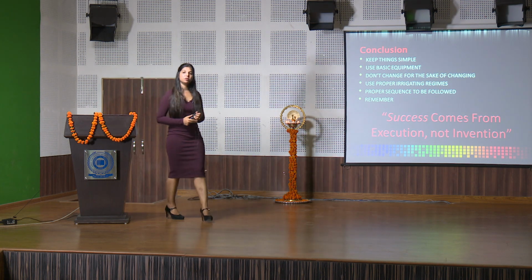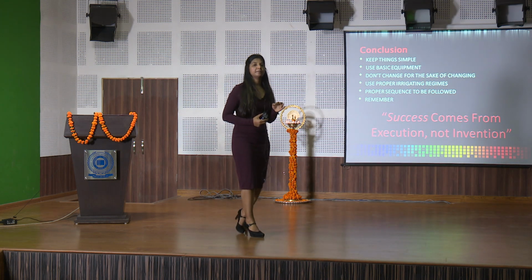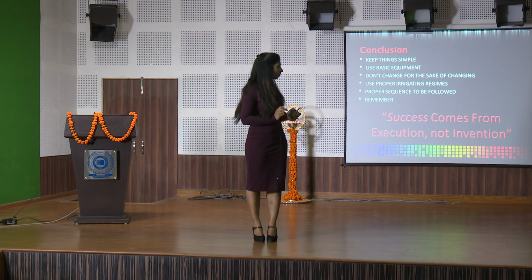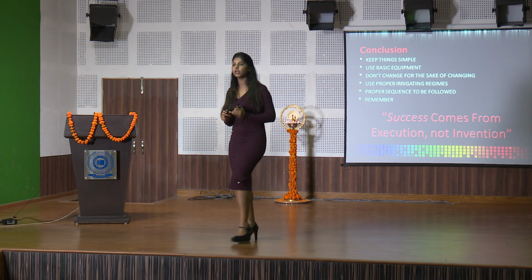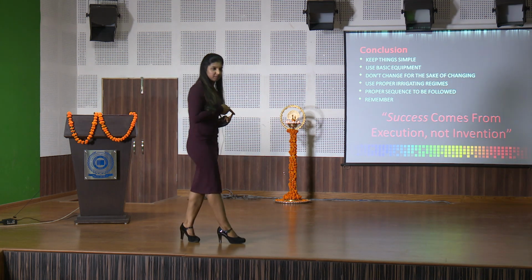Make sure that the core build-up that you do, as we have seen earlier, that coronal restoration plays a very, very important role in the long-term prognosis of the tooth. The coronal restoration has to be a dual cure composite build-up. No glass ionomers, no simple composites.